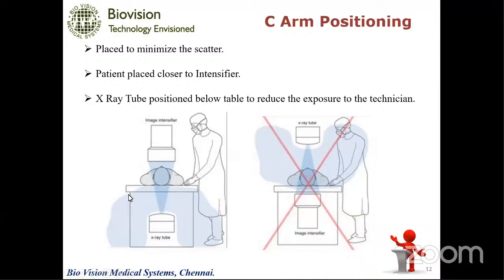I suppose you must be getting a doubt here. See, I'm using a normal OT table, which is a rigid surface throughout. I am using an X-ray source below the table. Will this table also appear in my X-ray image? This will be the greatest question. So no, this table will not appear in the X-ray image.